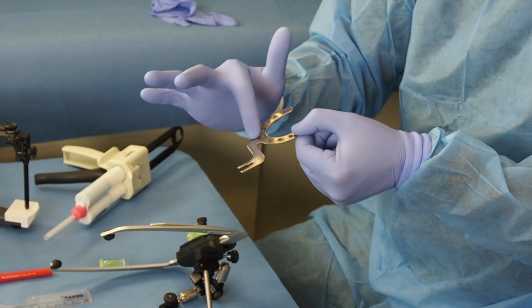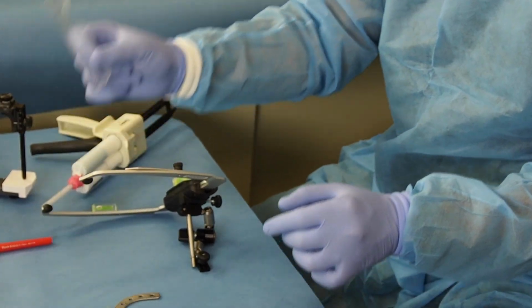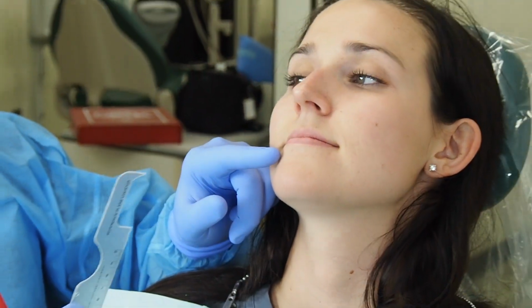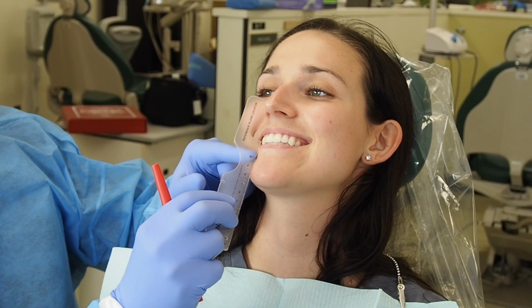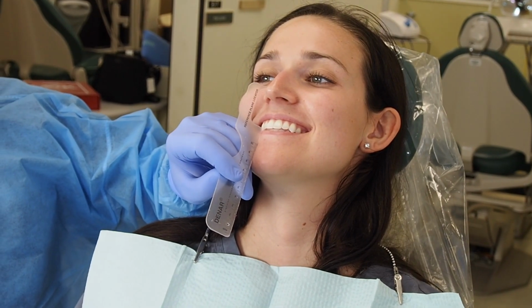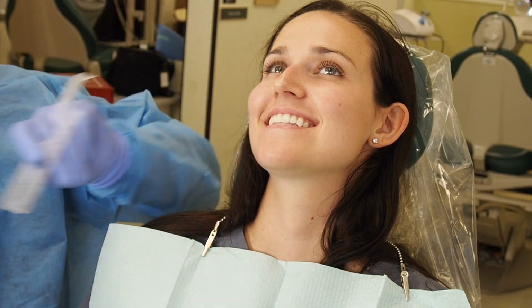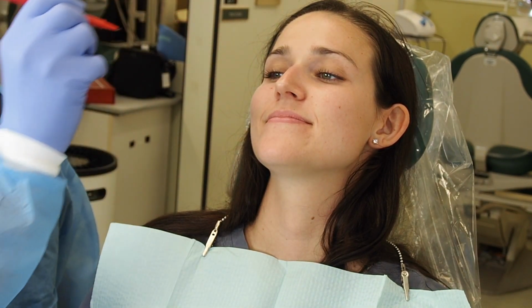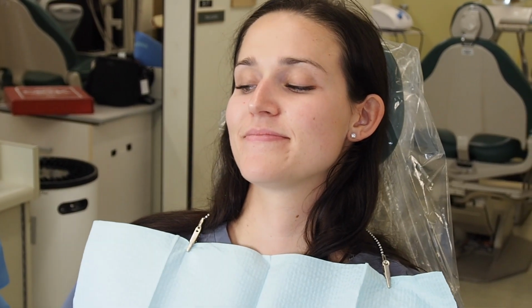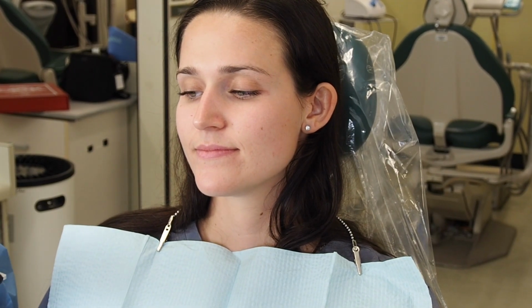We have a midline point right there. Okay? On my patient, I will mark the third point of reference where I will take her lateral. Smile for me. Thank you, patient. And then the point will point me up on that specific length. Right there, I'm gonna paint my patient a nice freckle right there. You can make a point, or you can make a little heart, or a little X, or whatever you want to place in there. That's gonna work for the third point of reference on the Facebow.